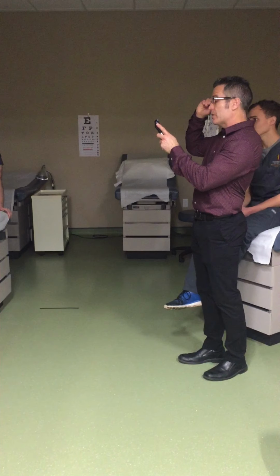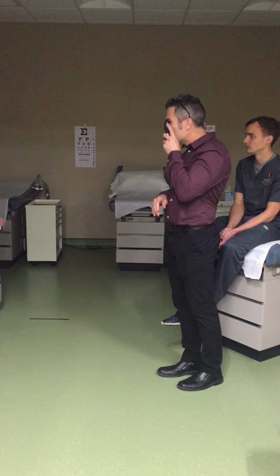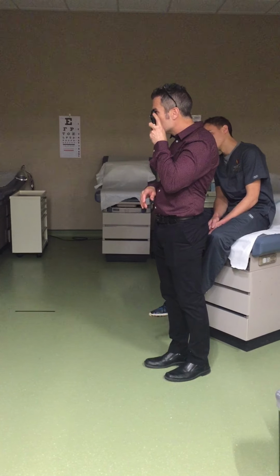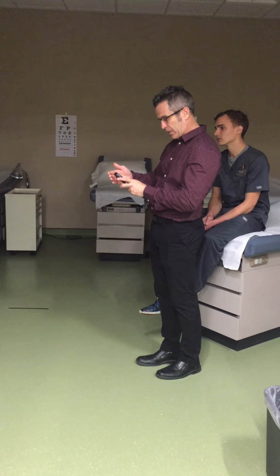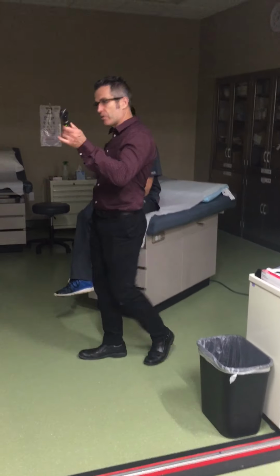And so now I'm going to look at this Purell sanitizer box until it comes into focus, about 8 to 10 foot away. Oops, that's going the wrong way. It's getting worse. Okay, I can focus on it pretty good about right there, okay? And so as I get older, the worse I'm getting, okay? And so what I do is I got my focus. So now cut the light off, Sid.